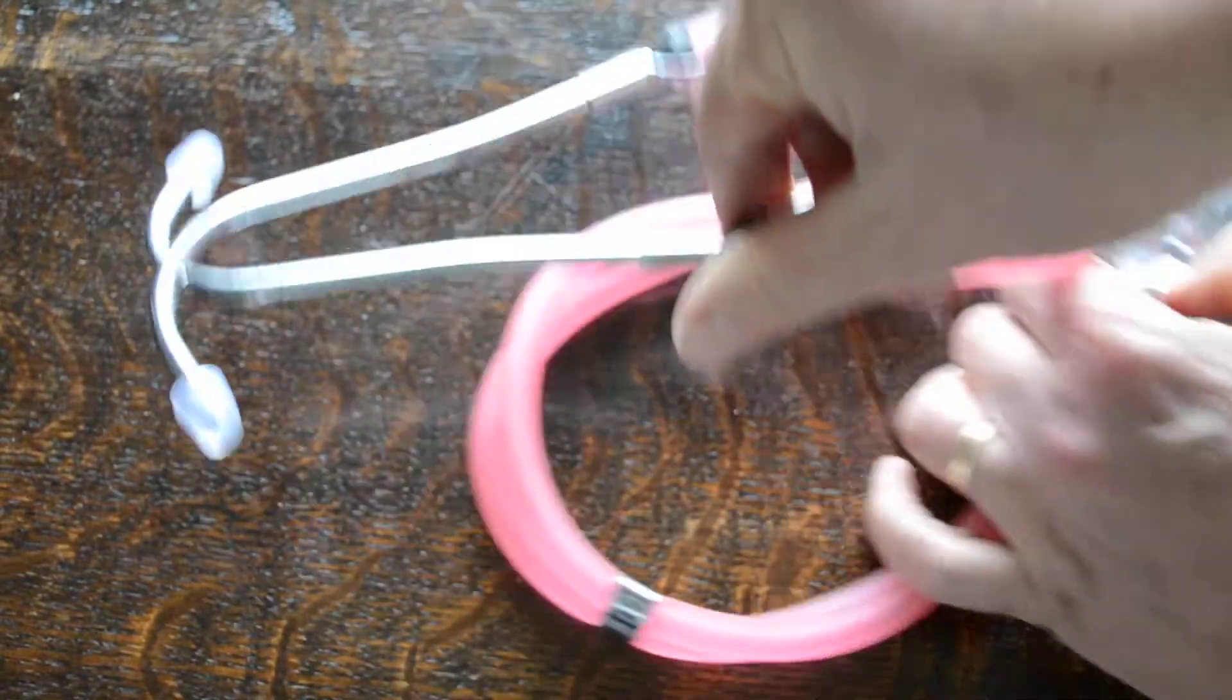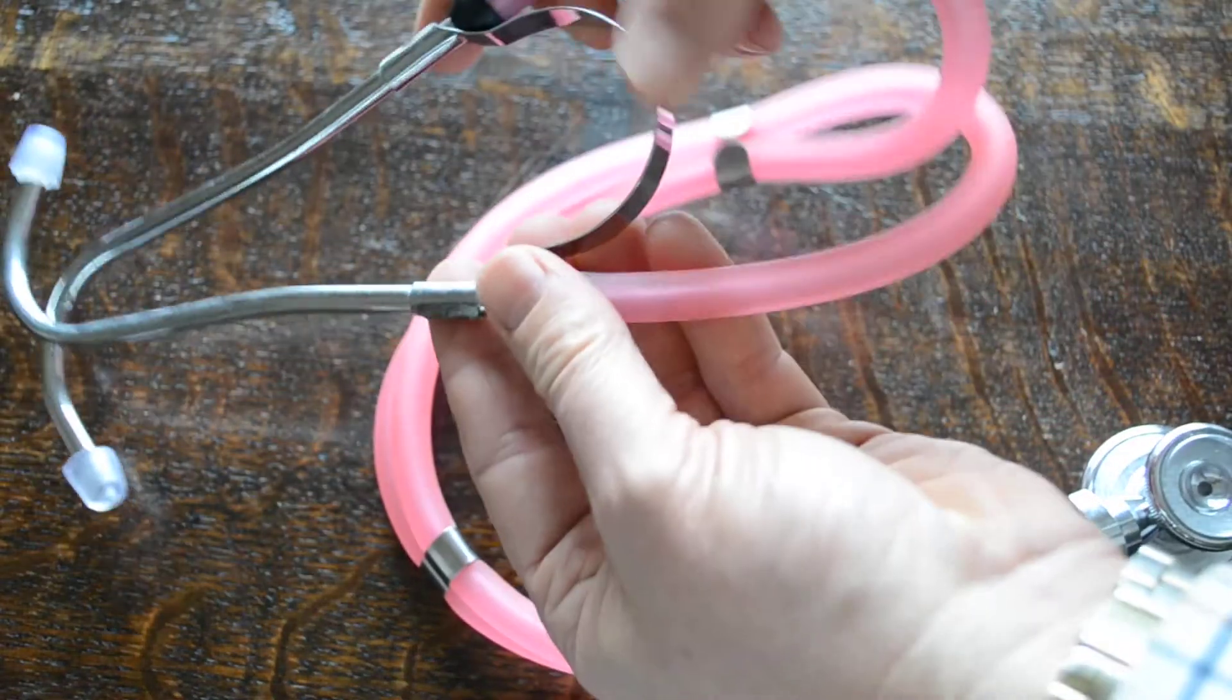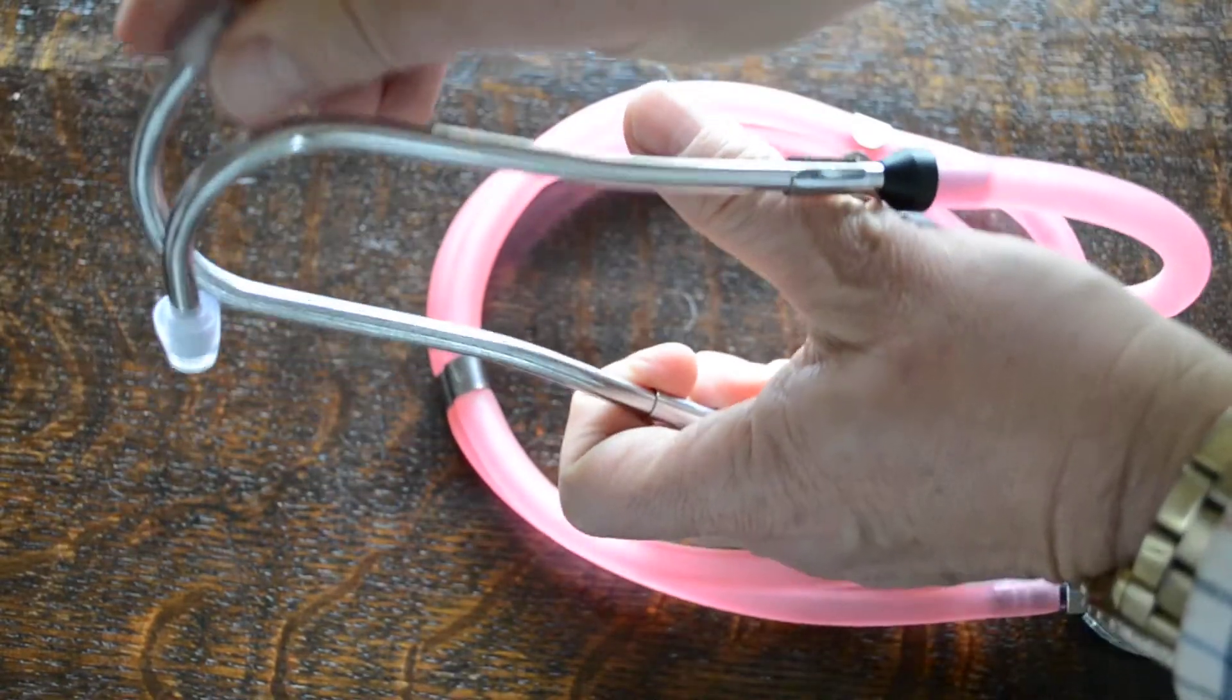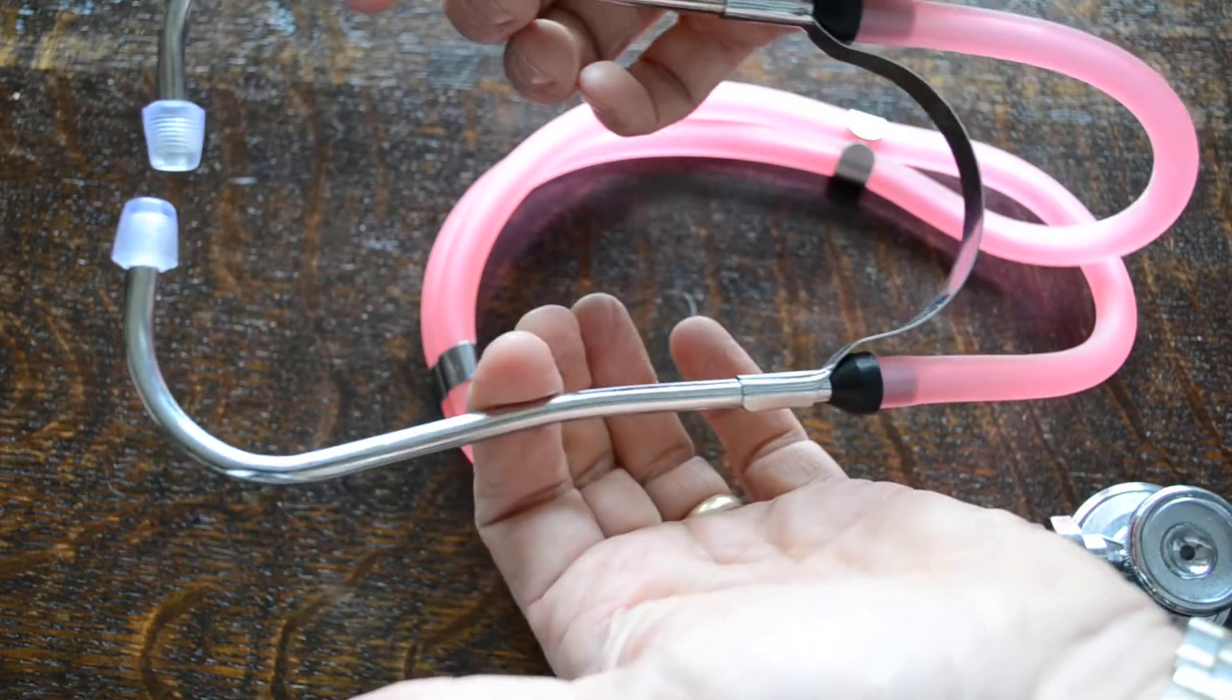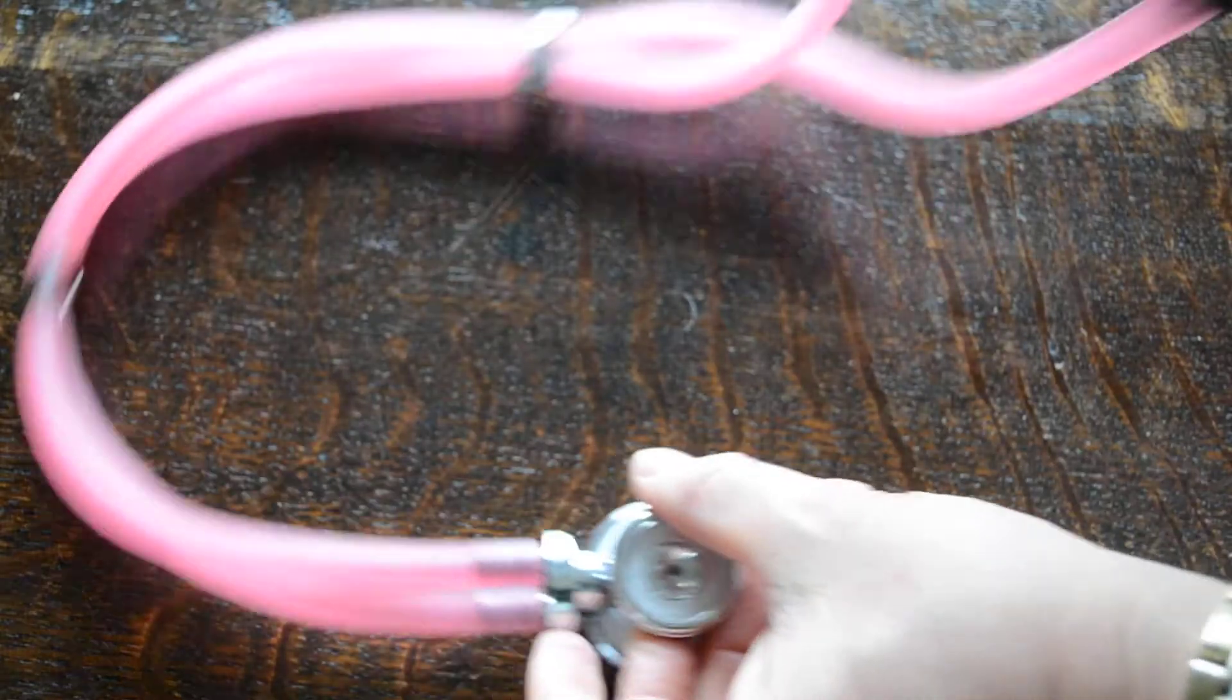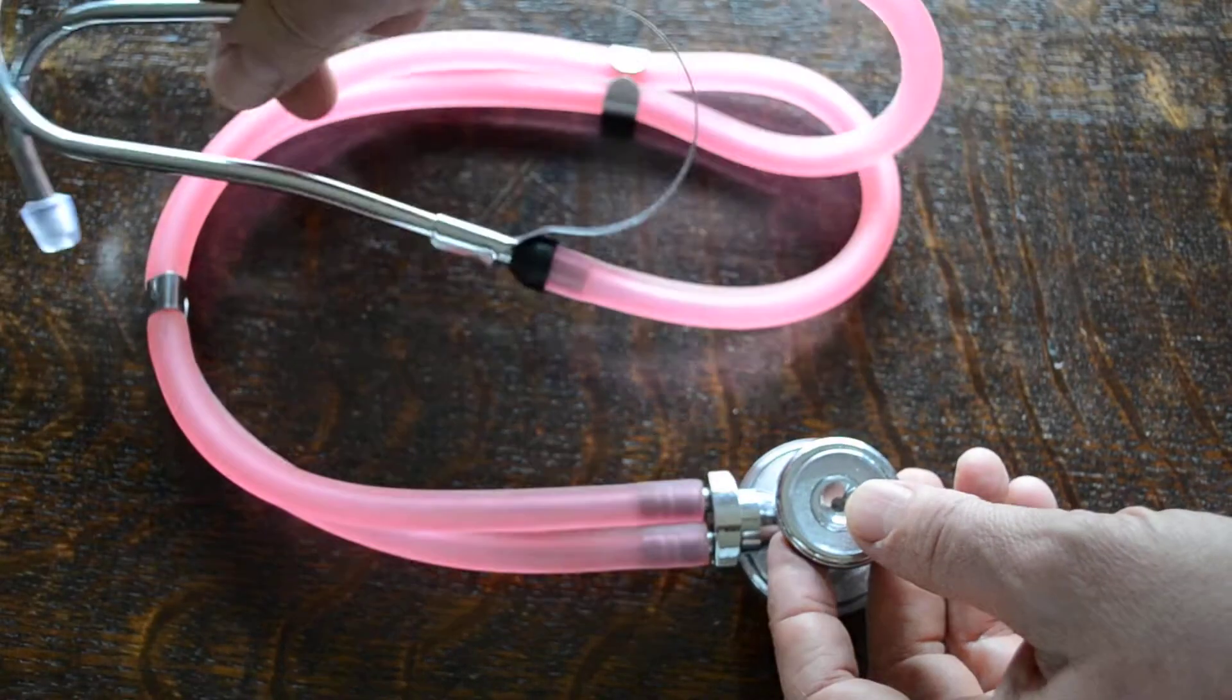The headset on this unit is a standard sprung piece, standard steel springing with a see-through soft graded ear tip. It's quite comfortable in use, not too strong. The springing on that 56 to 58 centimeters total length on the tubing, so it's a full-size tubing.